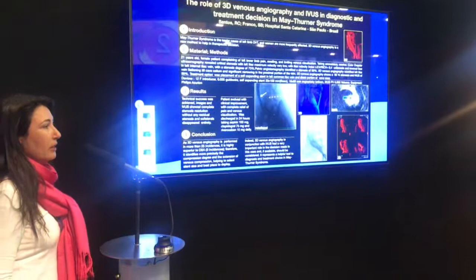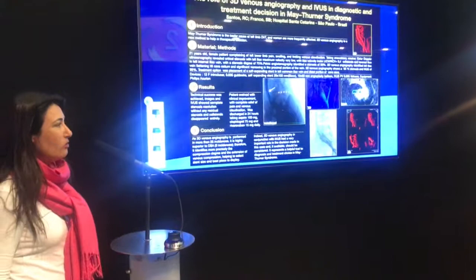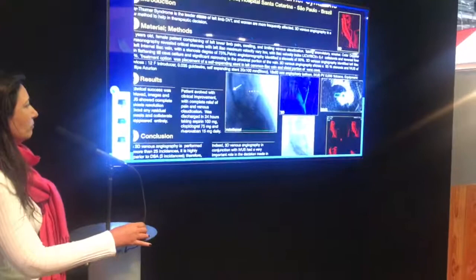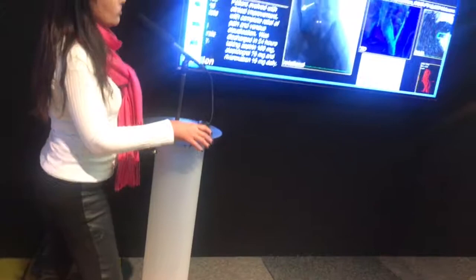During the procedure, we performed 3D venous angiography, as you can see in these pictures. The rotational acquisition revealed a stenosis of 95%, and 3D venous reconstruction also showed the degree of stenosis.